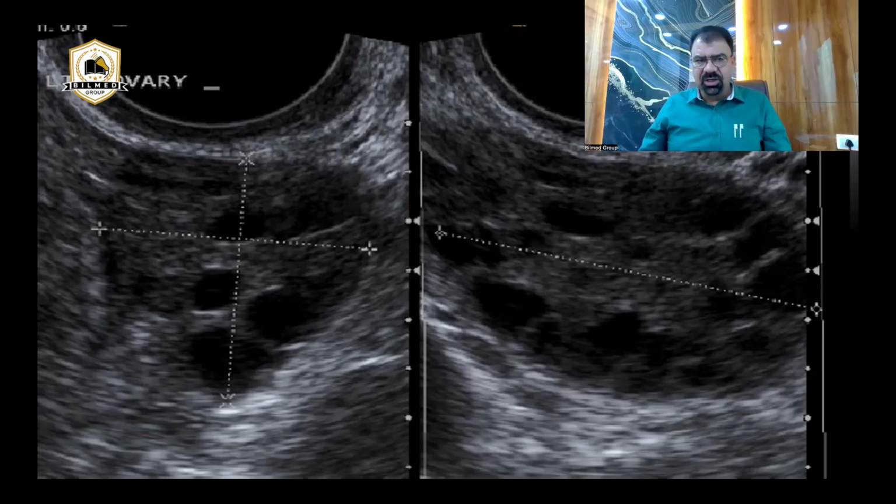I'm repeating the question. If I am increasing the pulse repetitive frequency, I am sending it more frequently. What will happen to the duty factor? Will that increase, decrease, or remain same? These types of questions are board type questions. When you appear someday for the ARDMS exams, these questions will surely be there.